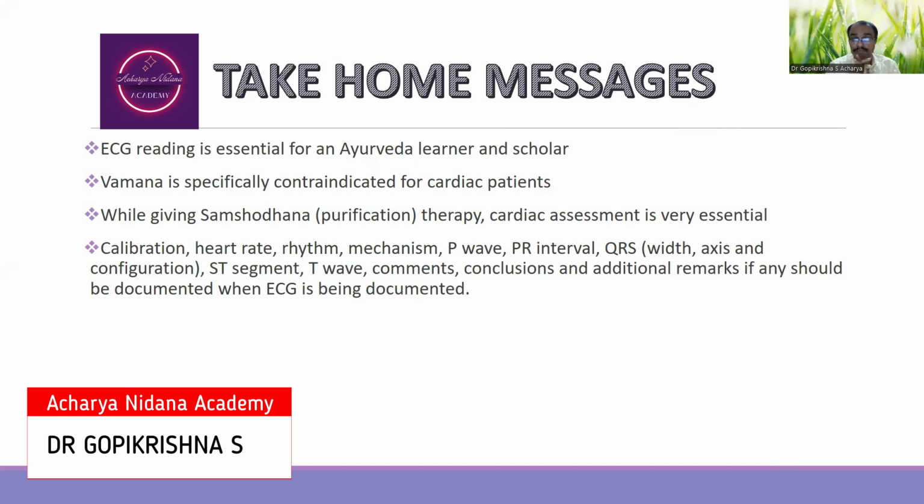So mechanism means whether it is sinus mechanism, nodal mechanism or ventricular mechanism. Then P wave, PR interval, QRS complex in terms of width, axis and configuration, ST segment, T wave, comments, conclusion and additional remarks have to be noted if you are documenting the readings of electrocardiogram methodically.